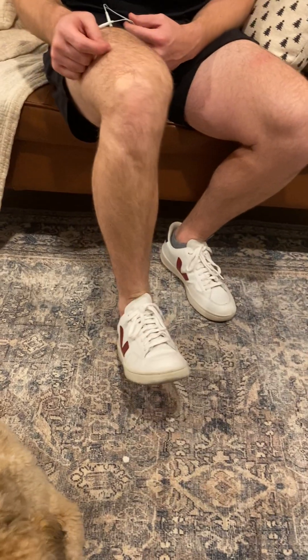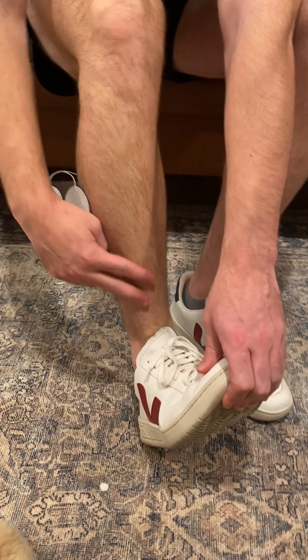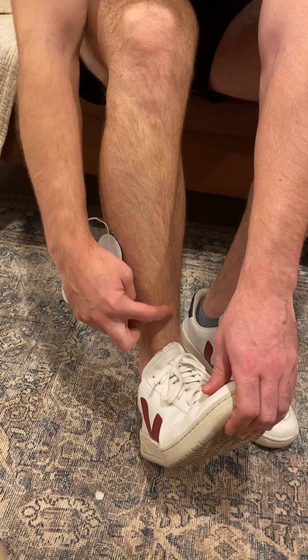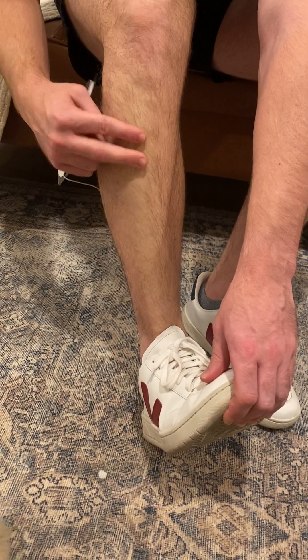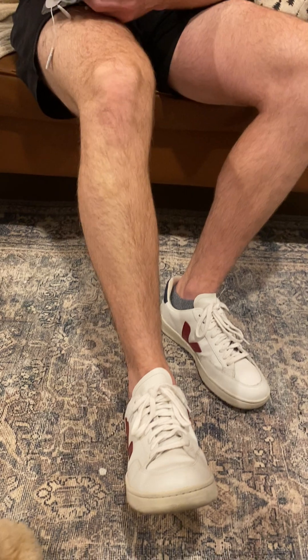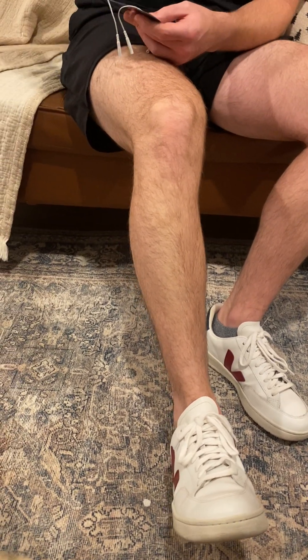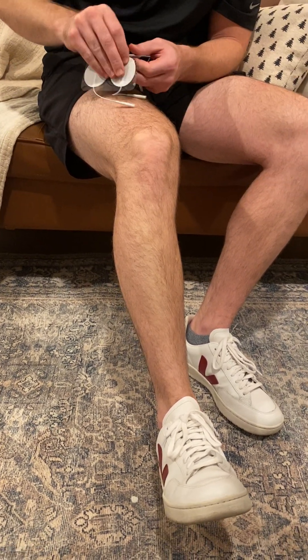For a patient that has a foot drop, they're not going to be able to do this for you, so you're going to have to take their foot and bring it up. When you bring up their foot, you're going to see the outline of this muscle on top. You can feel the shin bone here, and right off that shin bone you feel a muscle running up the leg that gets thicker as it comes up. That is the muscle where you want to put the electrode pads. This is a smaller muscle, so you're not going to need the big electrode pads — you can stick with the standard size electrode pads.